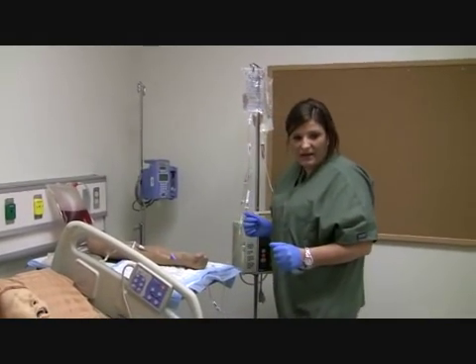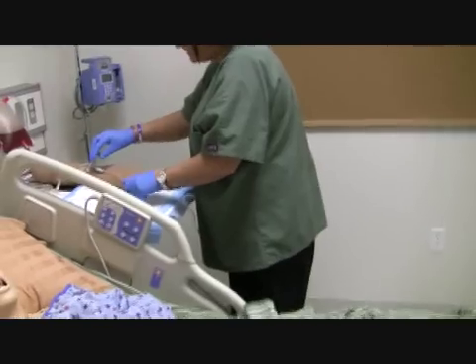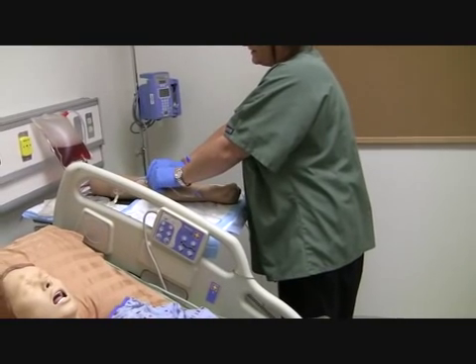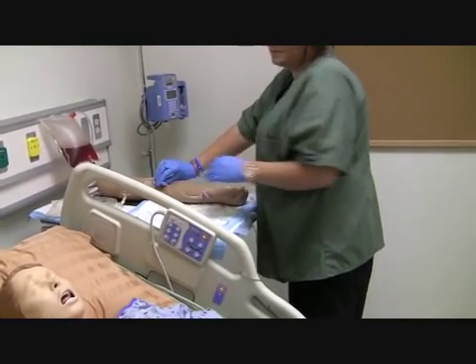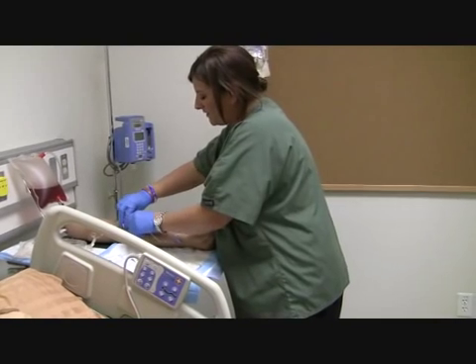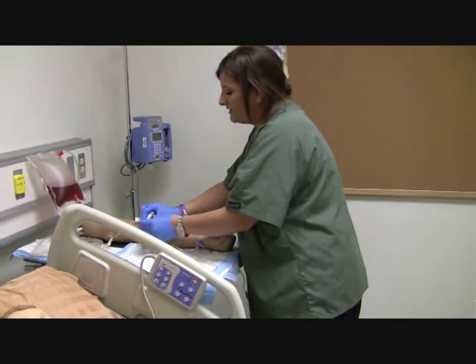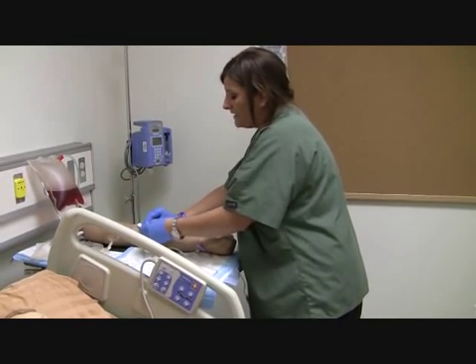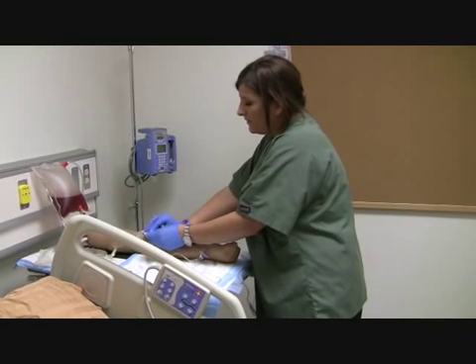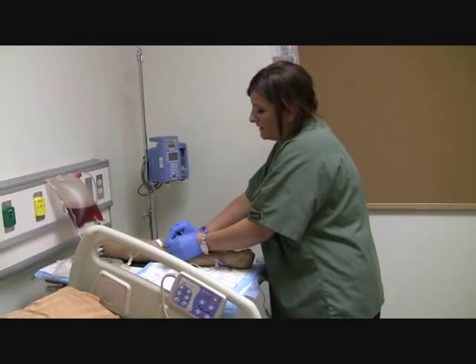Since the other solution is running, we're going to have to disconnect it. Okay, so I have my alcohol, and I have it ready. I'm going to go ahead and disconnect this. I'm also going to be assessing the site. I'm going to make sure that the right catheter size is in there. For my blood, it needs to be either an 18 or a 20 gauge, preferably 18. We're going to clean the end of the J-loop for 20 seconds. We're assessing the site and making sure that it's not infiltrated, it's not red or warm, and that it's patent.